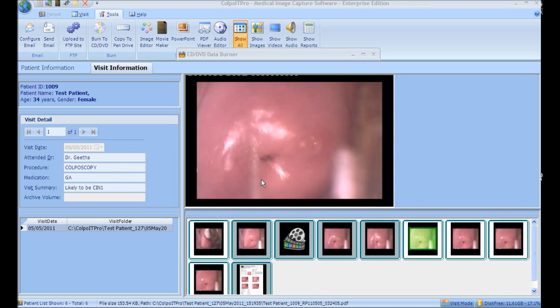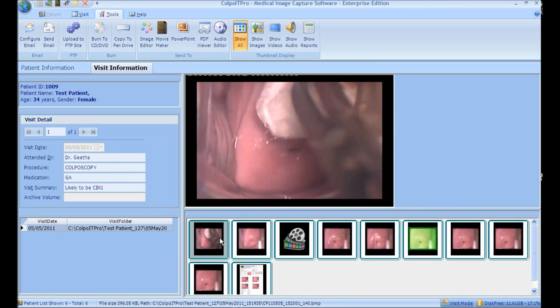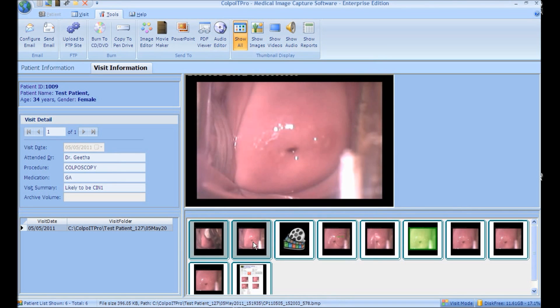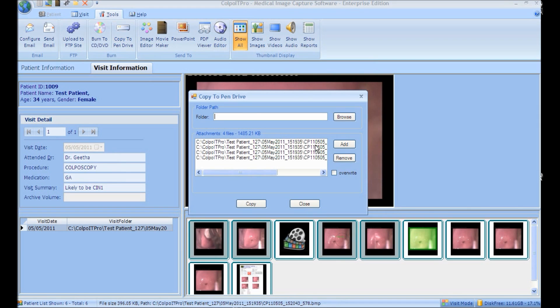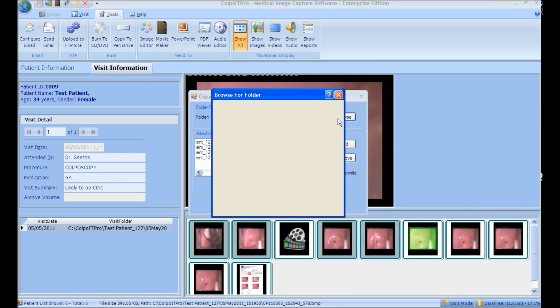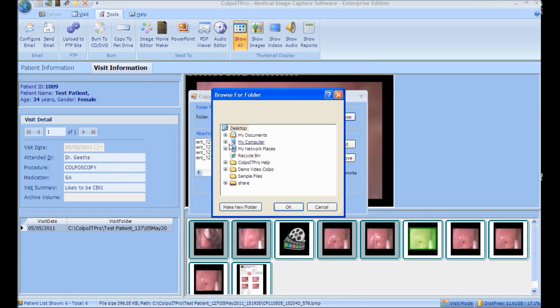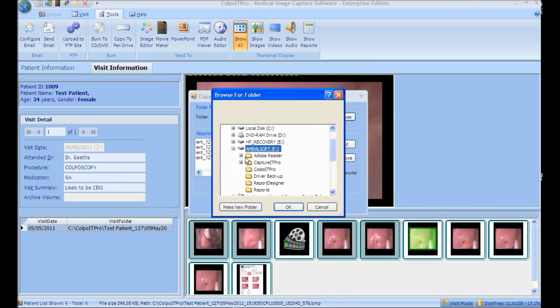Copy to Pen Drive: to copy to a pen drive, select the data and click the respective button. The data is added. Browse and select the folder path to copy. On clicking Copy, the files are copied to the desired folder.